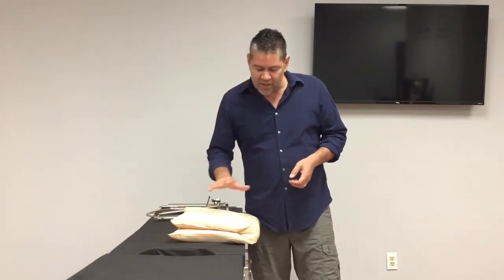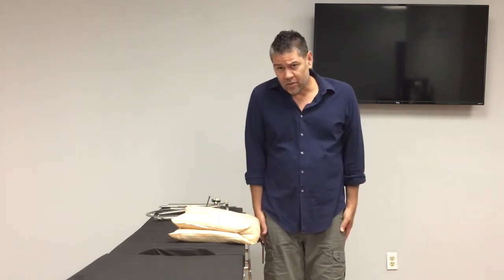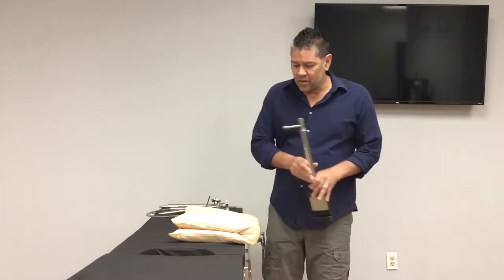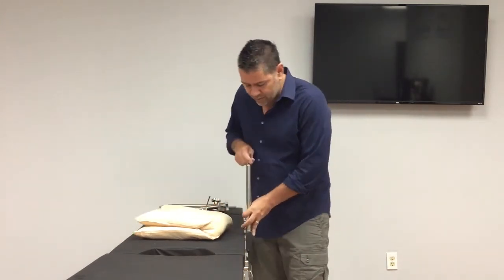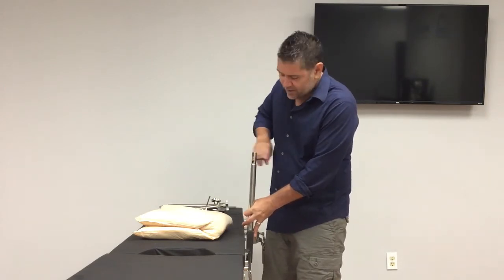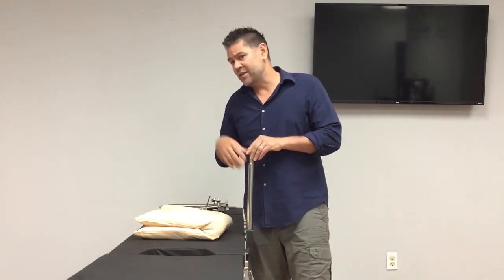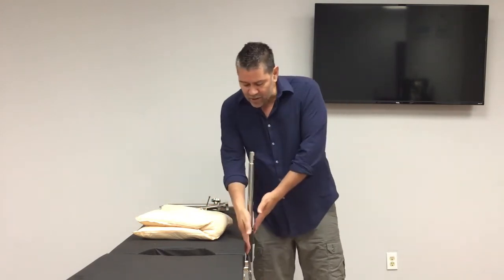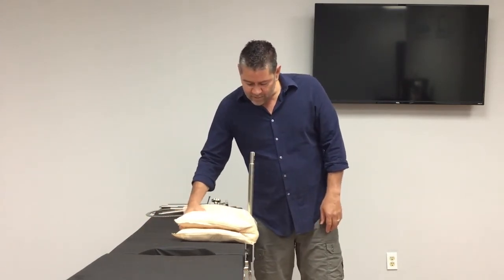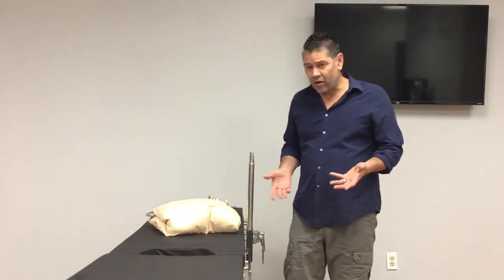But if my patient was hanging over this way because they were obese or their arms happened to be tucked, if I needed to use a fixed post retractor system, you can see that the spatial difference here could create harm. And these things have been around forever. They're great. When they were invented, we probably didn't have the patient population that we do now as it relates to obesity. But as you can tell, this lines up with the rail structure here. So if my patient was hanging over, it would actually indent and create the opportunity for harm.